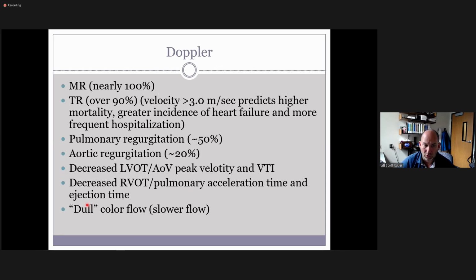And sometimes when you discover that your numbers start to tell you something that's kind of borderline moderate and severe, and you need to make that determination, sometimes you need to go back and take extra pictures to make sure that you gave the best information. And if you've already left the room or the patient has left the hospital, you either have to call the patient back, it becomes a big problem.